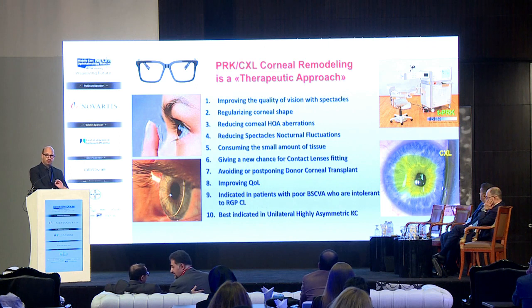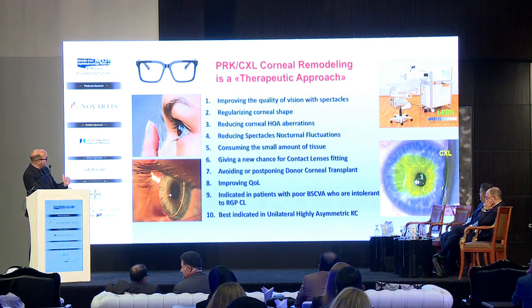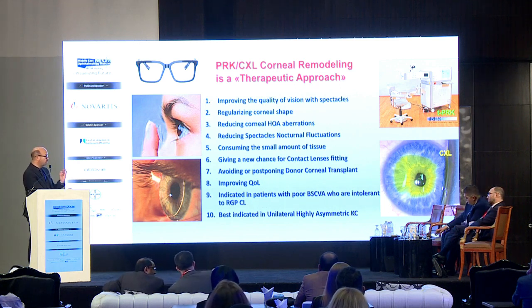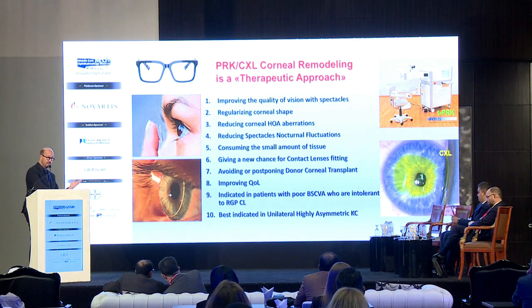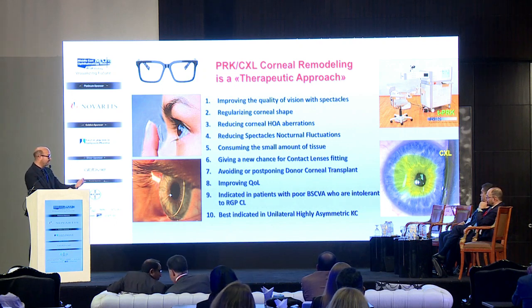We want to improve spectacle-corrected visual acuity, improving the quality of vision, regularizing the corneal shape, reducing the corneal aberrations, reducing the nocturnal fluctuations that these patients have with spectacles, consuming a small amount of tissue, giving a chance also for new contact lens refitting, avoiding or postponing donor cornea graft.